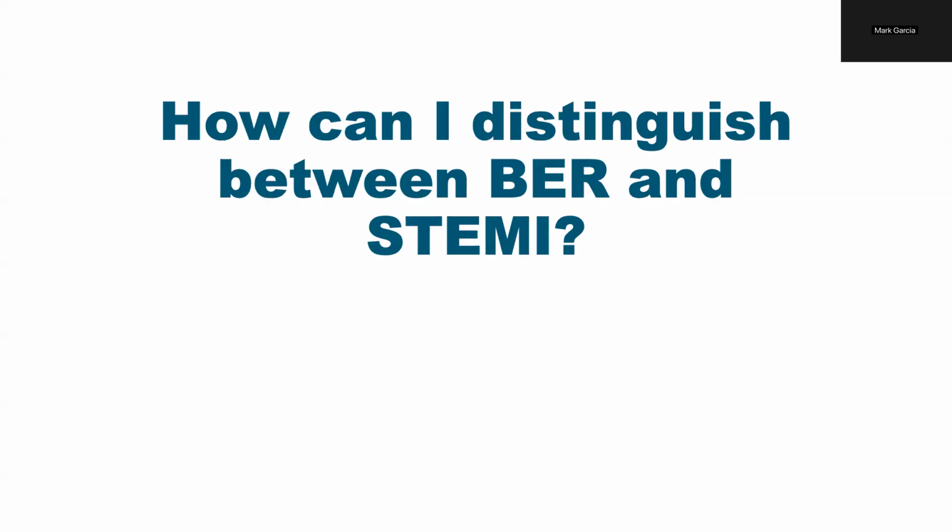In fact, there's a syndrome called early repolarization syndrome, which refers to the presence of a benign early repolarization pattern on the ECG in those who have actually been resuscitated following an idiopathic VF arrest. Regardless, this is still a rare complication of benign early repolarization, and the overwhelming majority of people with BER have no issues at all.